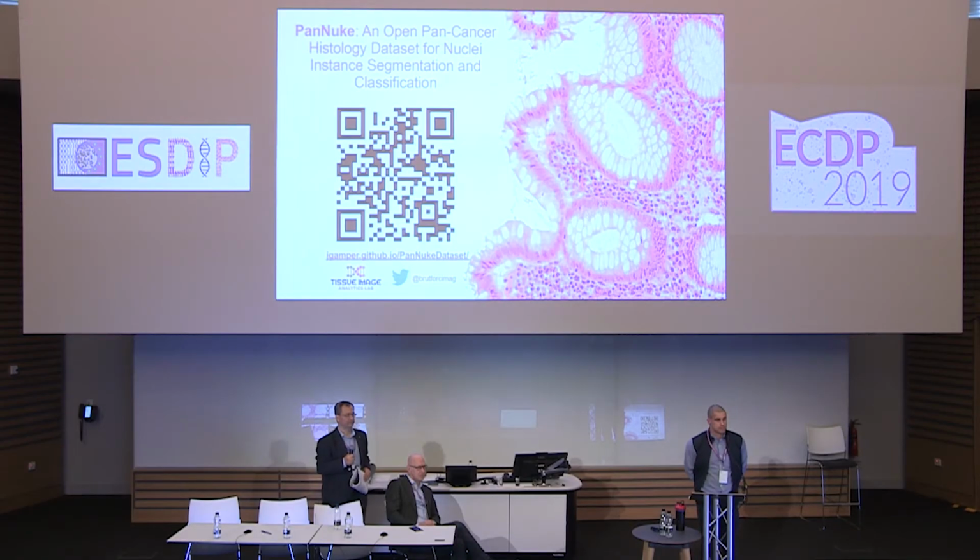In the SPIE challenge dataset, if you downloaded the whole slide images, you would have found some actual nuclei, point-based classifications for TILs, normal, and malignant. Yes, this is exactly what we've used. This is what I mean when I've mentioned SPIE. So you had 0 for the normal cells in that spreadsheet. So there were lots of normal epithelial cells. So from there, we mainly sourced malignant. Oh, okay. Because we had quite a few already for normal ones.